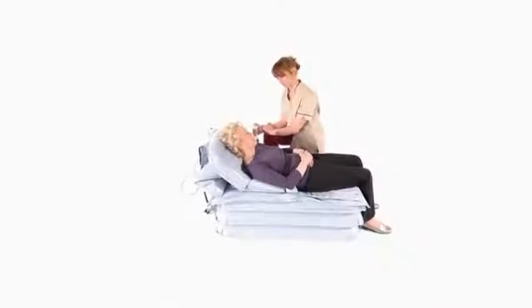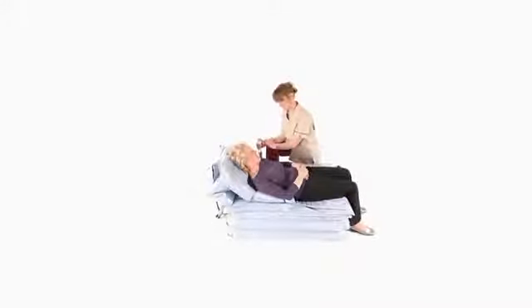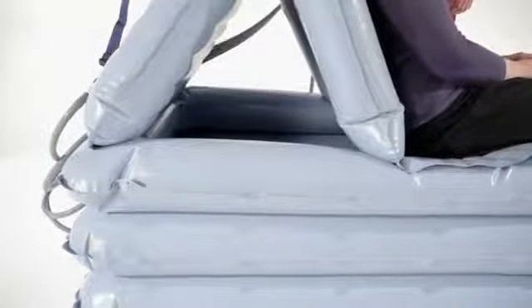Press and hold number three to inflate the third section. Three inflated sections will usually be sufficient to enable transfer, but a taller person may require all four.